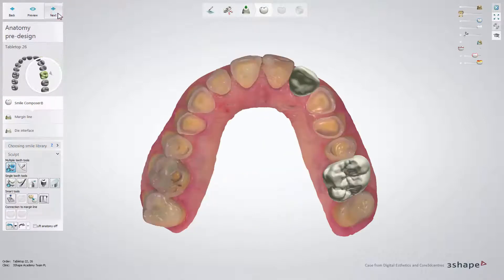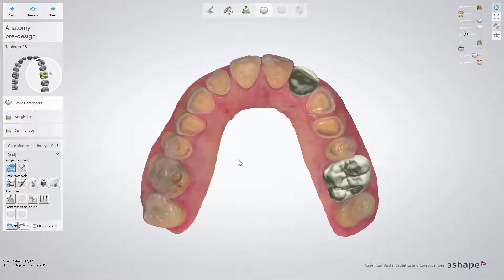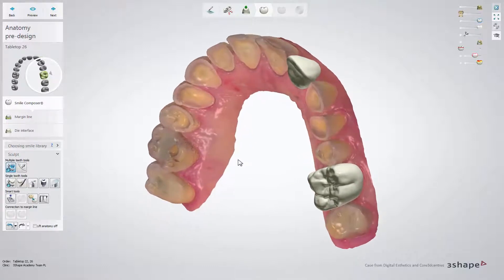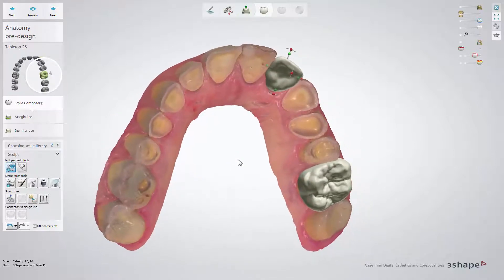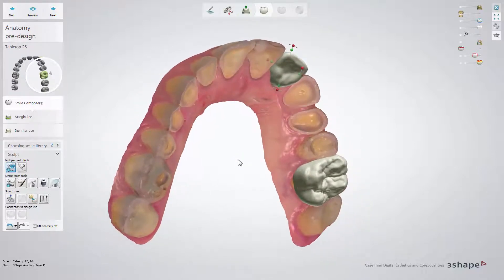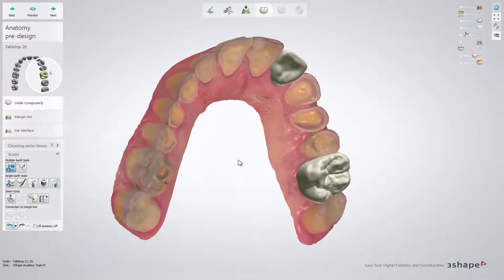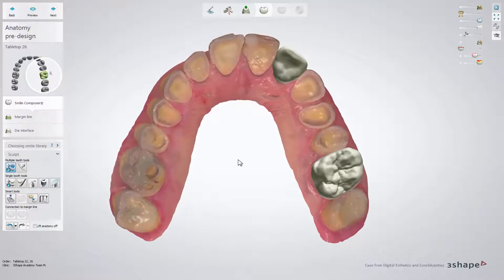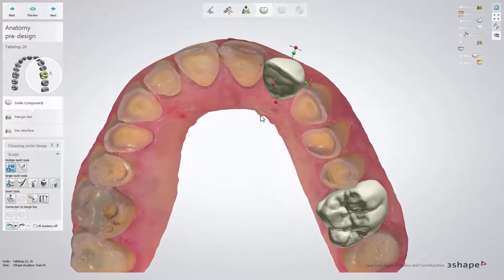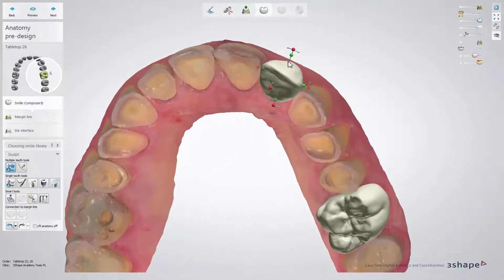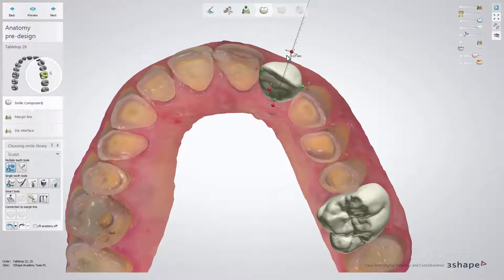Clicking next after setting directions for the last restoration takes you to the anatomy pre-design step. At this step, the Smile Composer automatically places teeth that you need to adjust to the surface you plan to restore to.